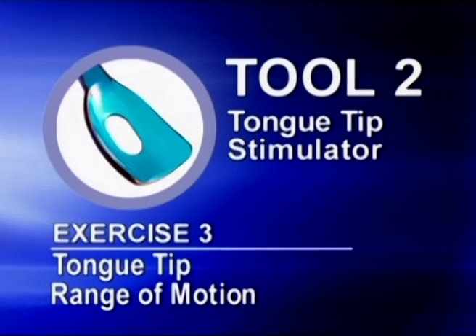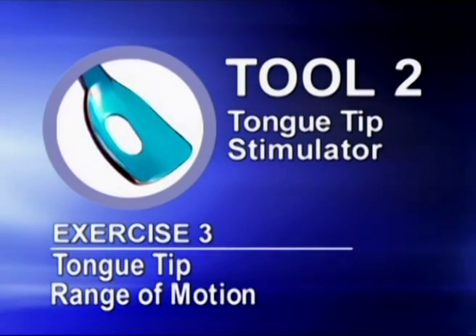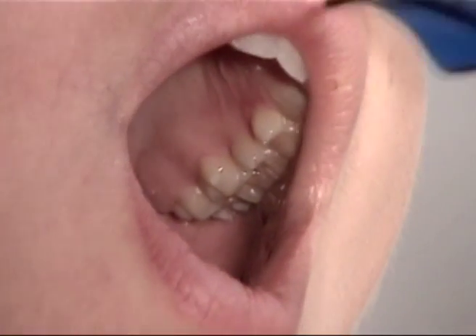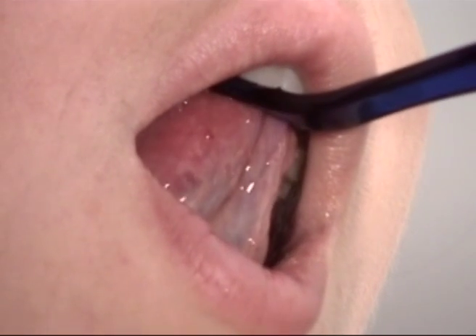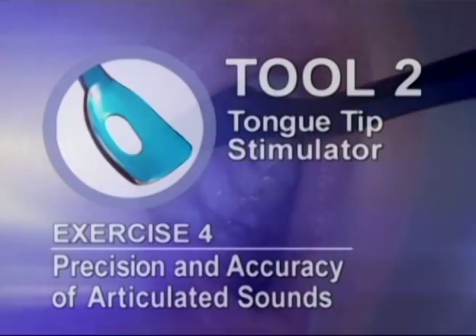The goal of exercise protocol 3 is to increase range and ease of movement of tongue tip elevation to a front palatal position. Place tool number 2 on the palate behind the front teeth. Elevate and lower the tongue tip in the hole opening. Repeat as many times as possible. Record the number of tongue tip elevations into the hole opening until fatigue.